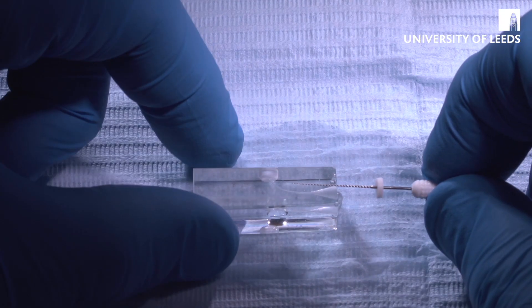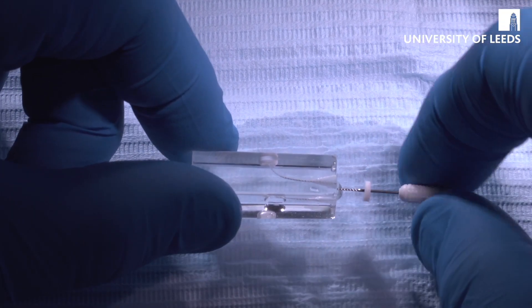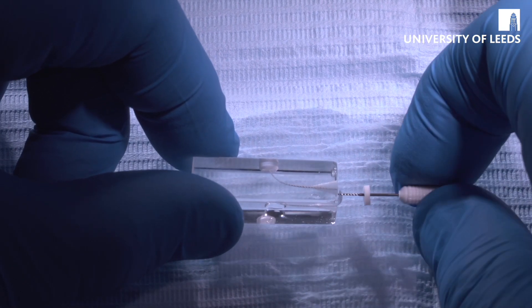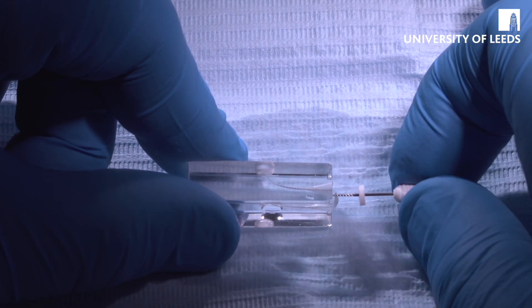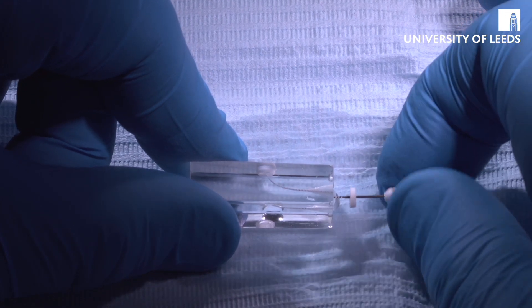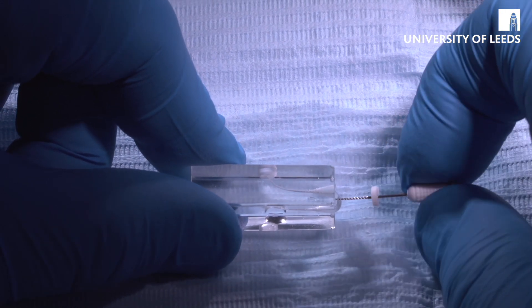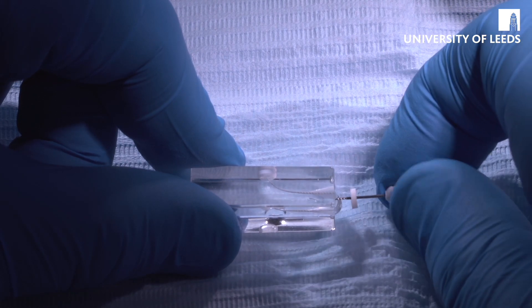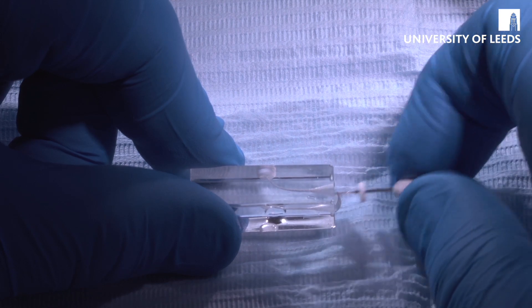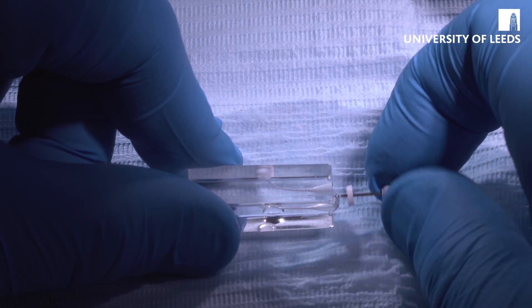Having gone in with the size 10, the next file we're going to use is the size 15, in exactly the same way. The file goes in, and again this is going just past the curve, which is absolutely fine because that's the first part we're going to instrument. Watch-winding again, with a little bit of translational movement, and as we increase the filing it's going progressively further.